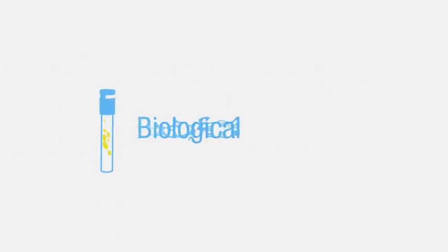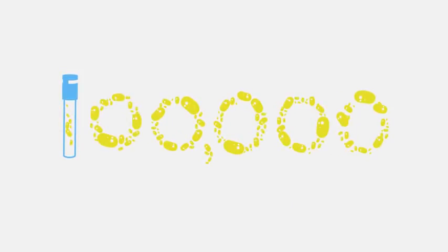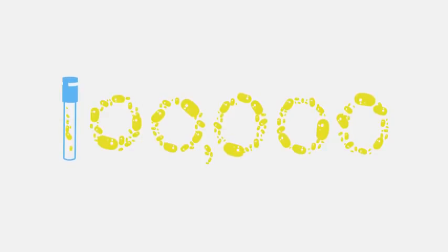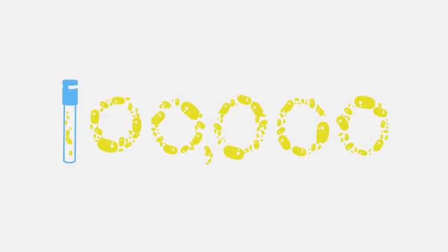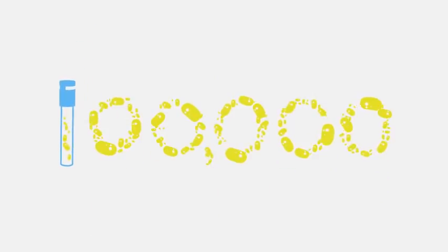And a biological indicator, BI, is a monitoring device that contains viable microorganisms and provides a defined resistance to a specified sterilization process. A steam BI contains at least 100,000 highly resistant spores. When those spores are killed during the sterilization process, it confirms conditions are sufficient to kill lower levels of less resistant microorganisms. Microorganisms like those on adequately cleaned surgical instruments, which typically carry less than 1,000 microorganisms. These vegetative pathogens are serious, yet more easily destroyed than the 100,000 plus highly resistant spores in a BI.